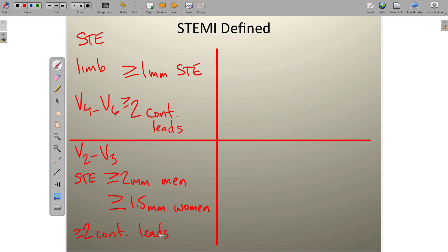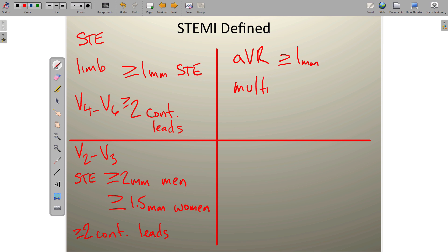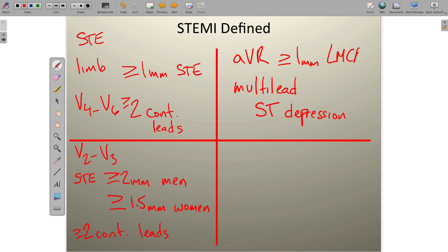Next, we look for ST-segment elevation in lead AVR. This lead is gaining more attention as a predictor of left main coronary artery occlusion or LAD occlusion. We need ST-segment elevation of greater than or equal to 1 millimeter in AVR, combined with multi-lead — or diffuse — ST-segment depression throughout the rest of the tracing.